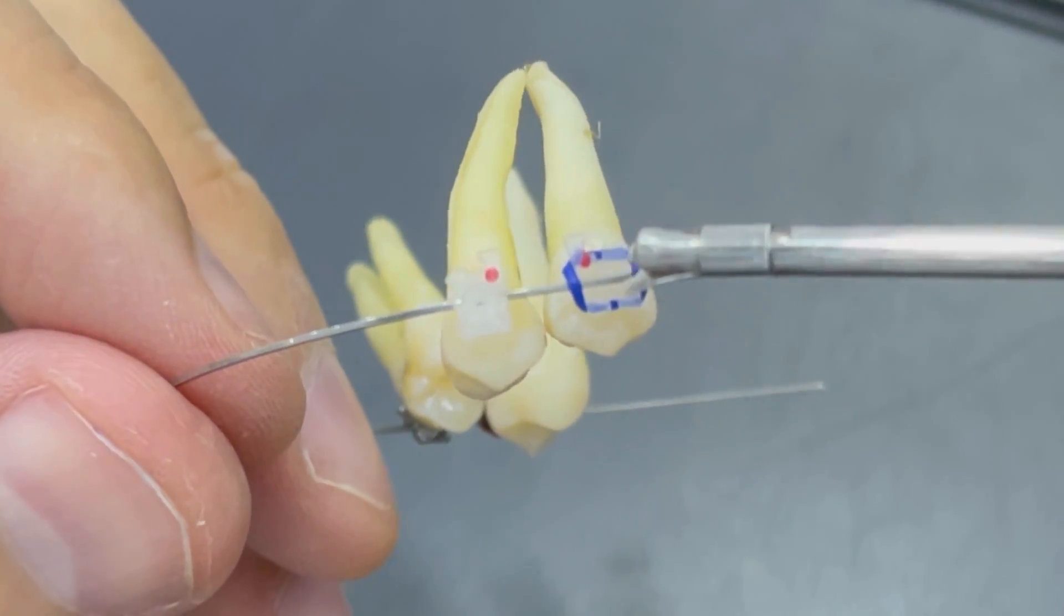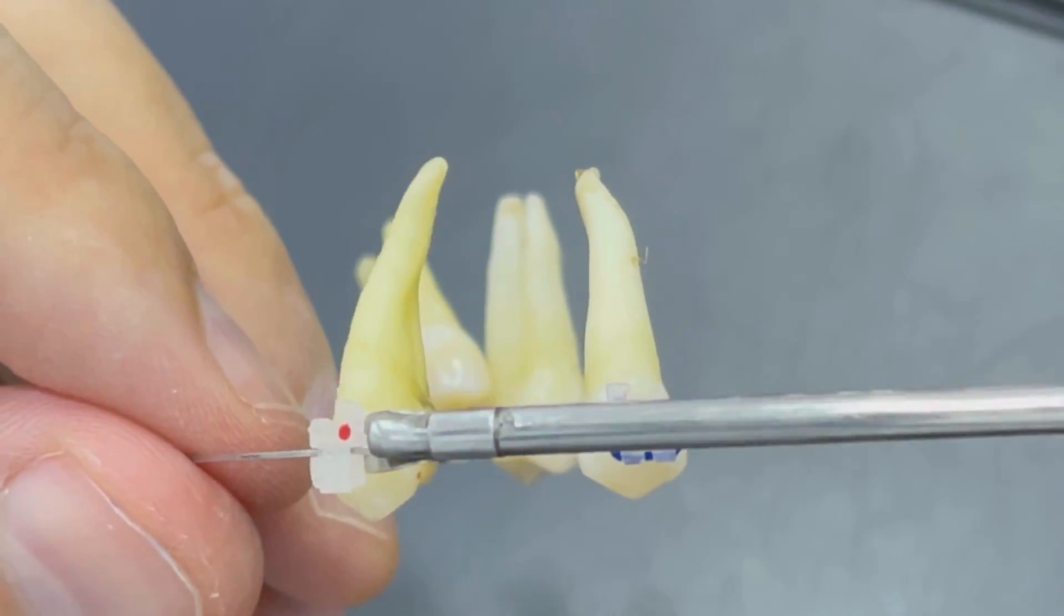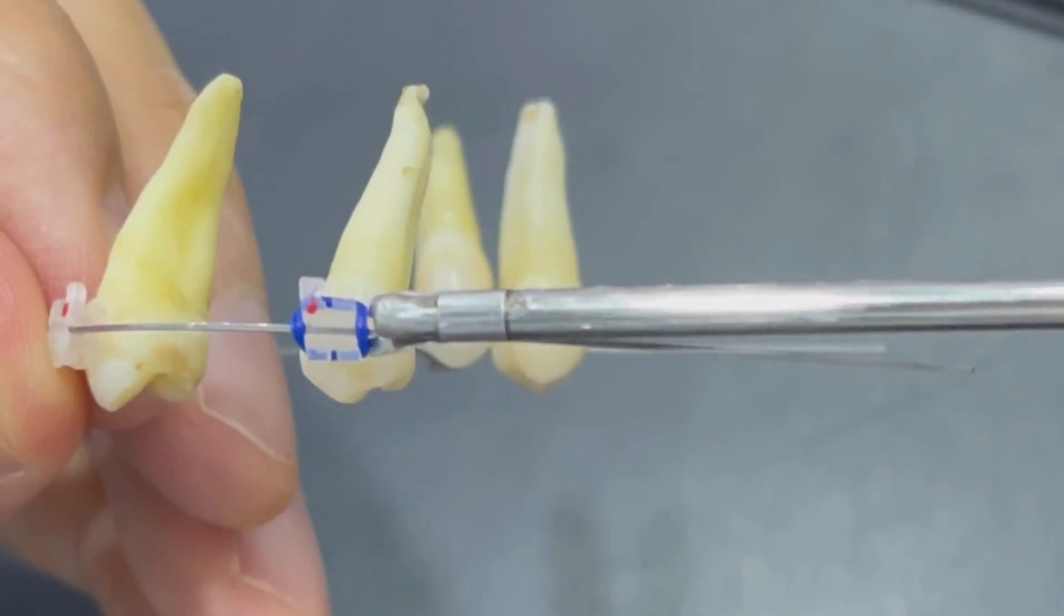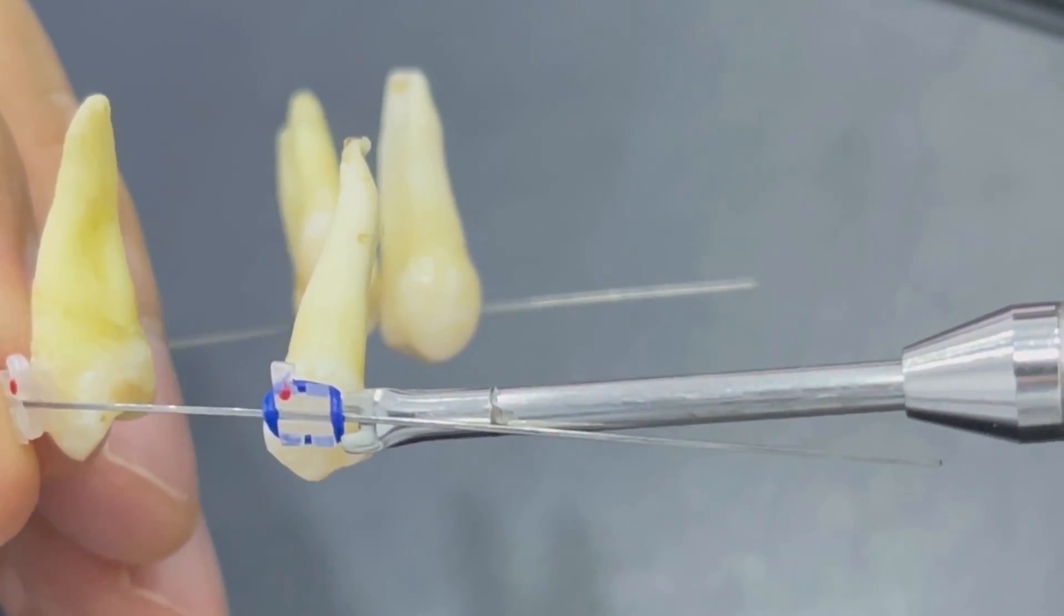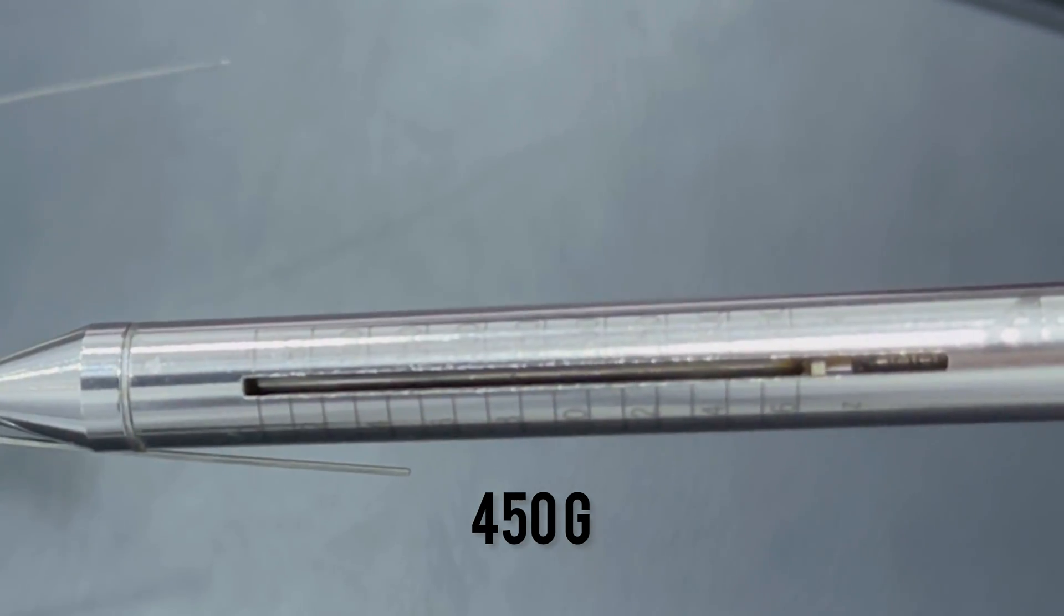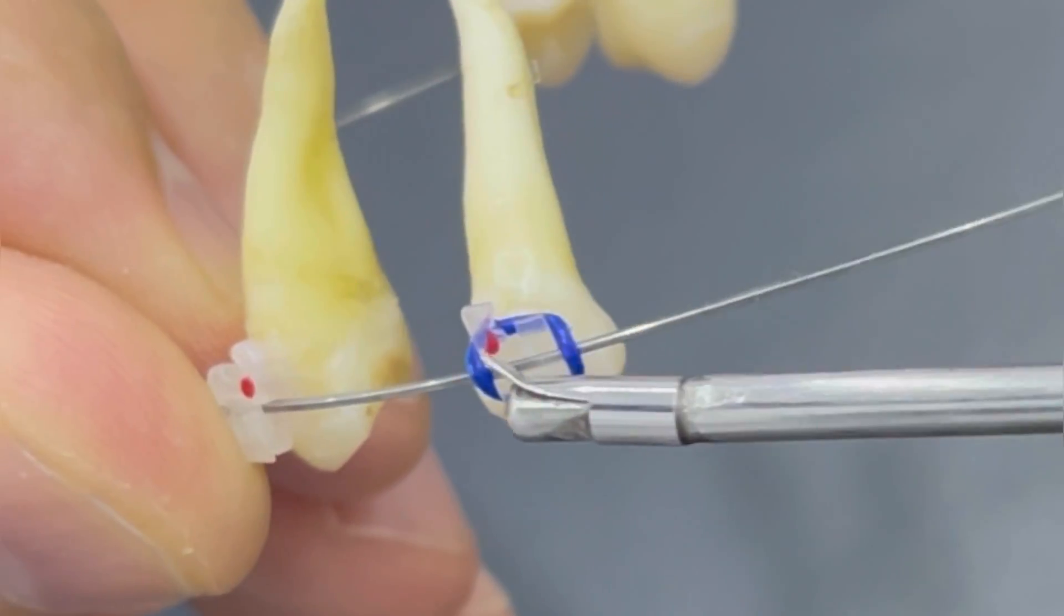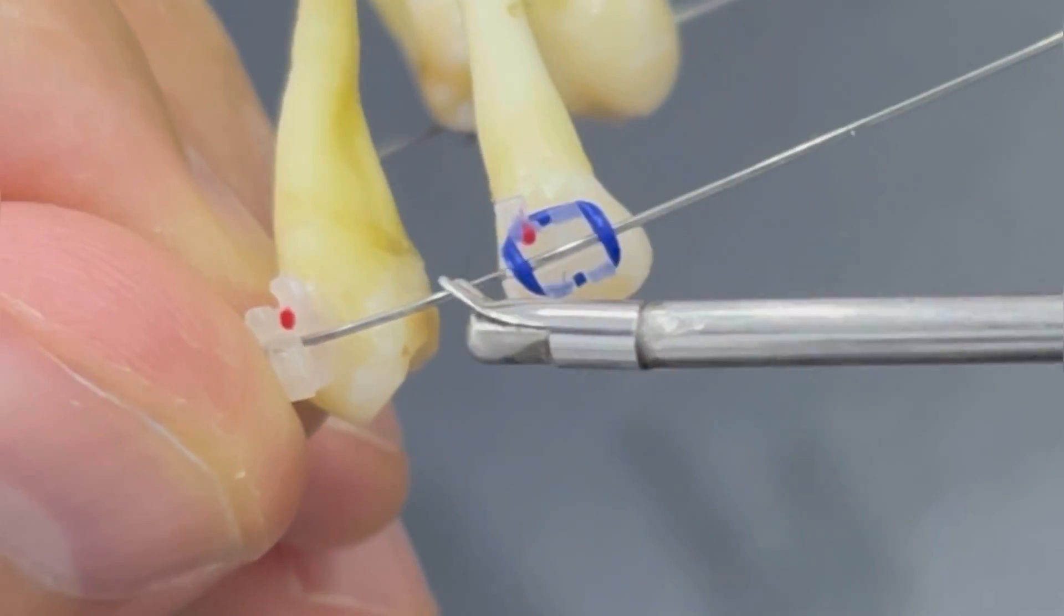Ceramic also has two types: ligating and self-ligating braces. The self-ligating, you can see, is moving very fast and smooth without any resistance, while the ceramic ligating braces require very heavy force, around 450 grams, to move a single tooth because of the friction between ceramic and the wire.